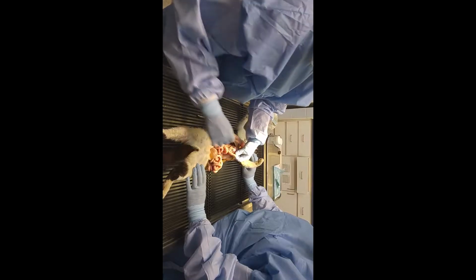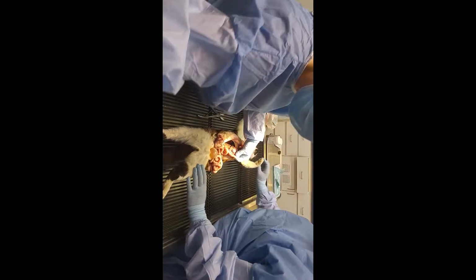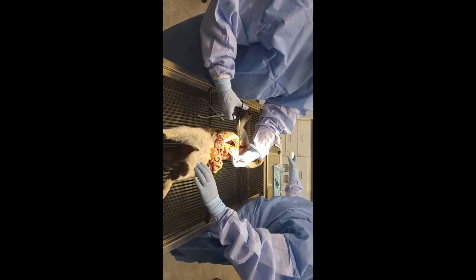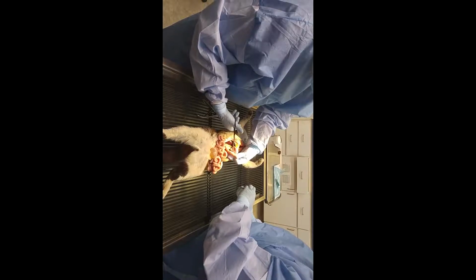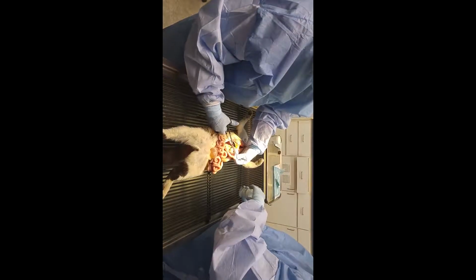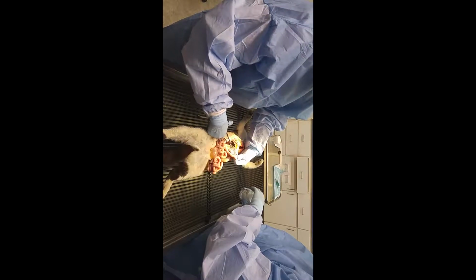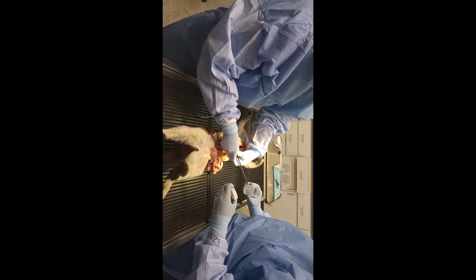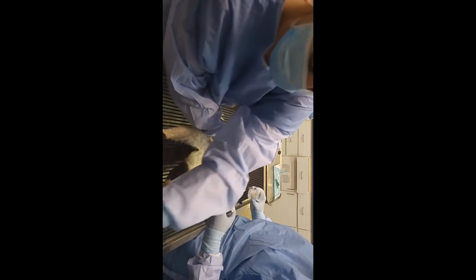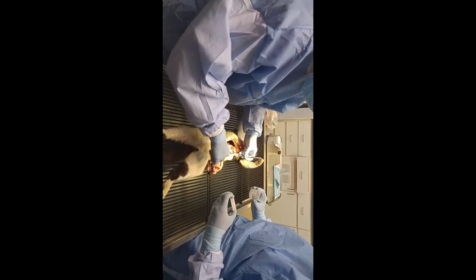So what I'm actually going to do is take a piece of the tissue and then have Jessica place it in our formalin container. And I'm going to try to get a piece here that is representative with those little whitish dots there. And use my forceps to.